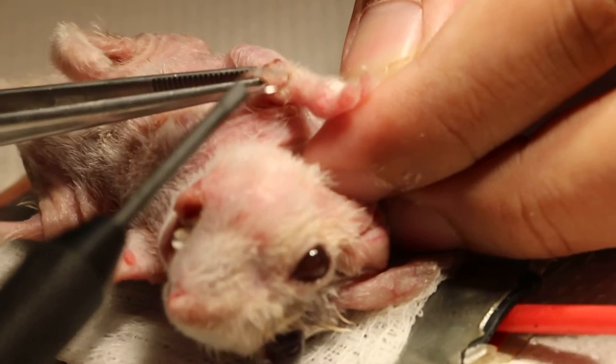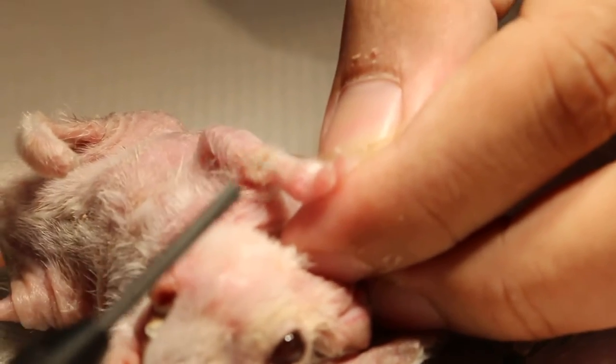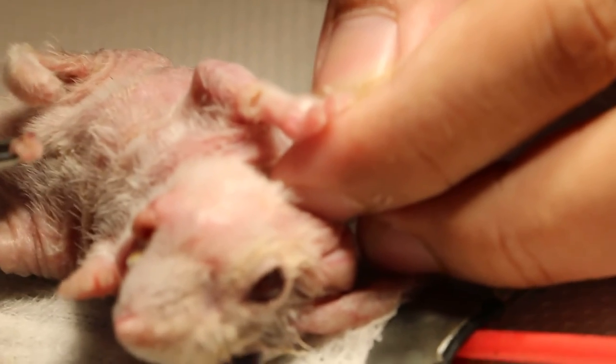This is a demonstration, just to show how it's done. There's no bleeding at all, which is very good. The hamster should be happy — she can go home.